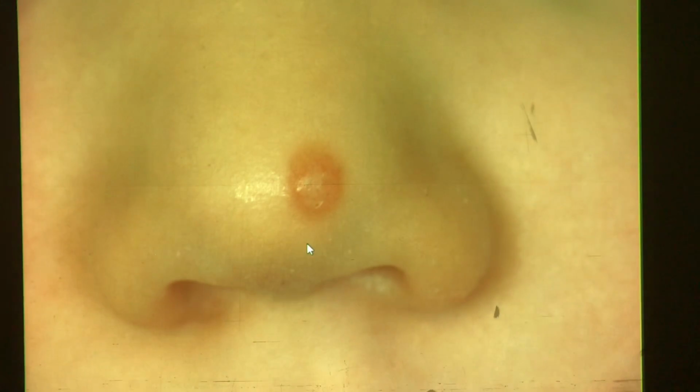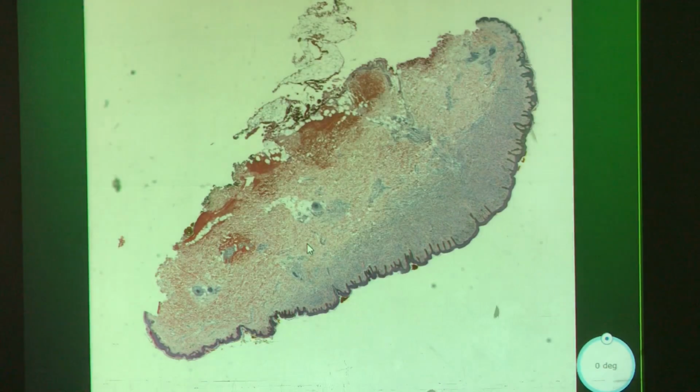Case 8. Okay, little tiny nodule looking thing. Not very terribly melanocytic, but it's raised. Kind of looks like a pimple. Almost. Not without the erythema. Okay. There's definitely something at low power going on in the dermis here.